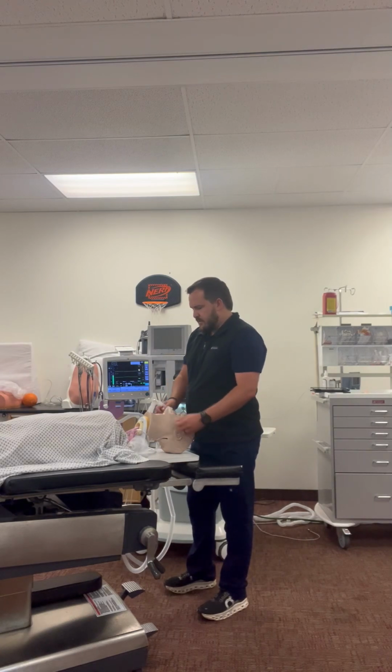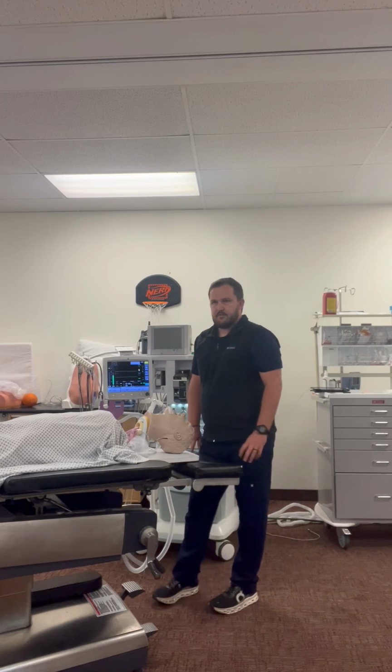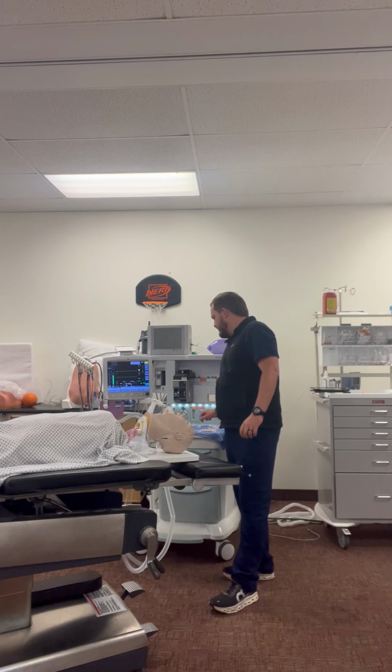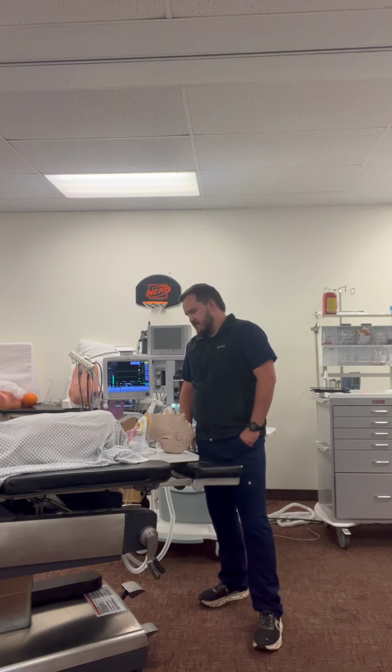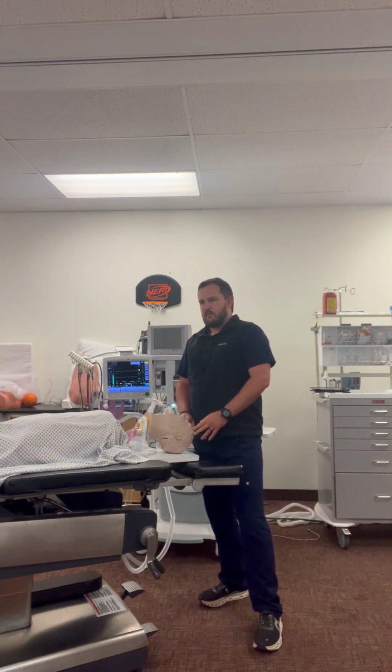Once he is intubated, I'll turn my gases back up to 2%, turn my oxygen up to whatever it needs to be. And then now I'm going to give some Decadron and Zofran since this is a short case to help with the post-op nausea and vomiting. I'll put some tape over his eyes, and then we're good to go on with the case. Once the case is over, we're now going to be looking for the emergence.